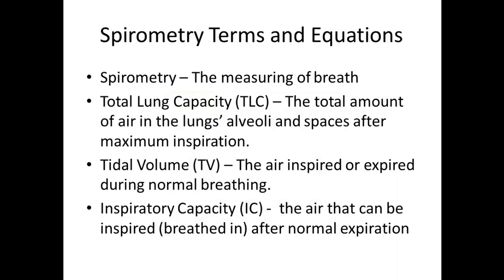In order to understand spirometry, you have to understand a few terms and some simple equations. Spirometry means the measuring of breath. Now this is a very important term because this is what we're going over. So what are we doing today? Well, I'm going over the terms you need to know in order to measure lung capacity or measure a full breath.